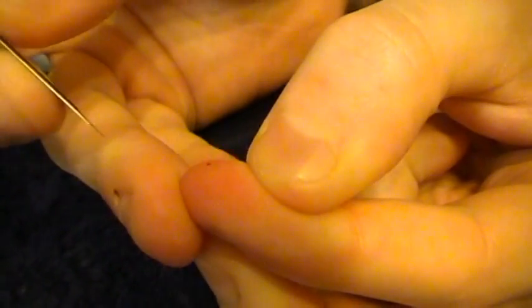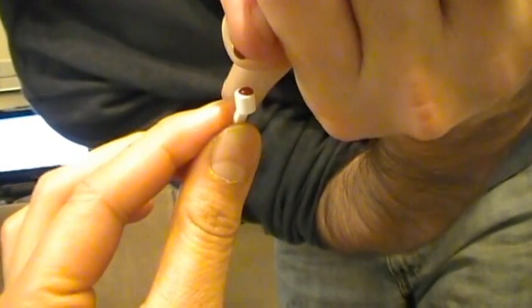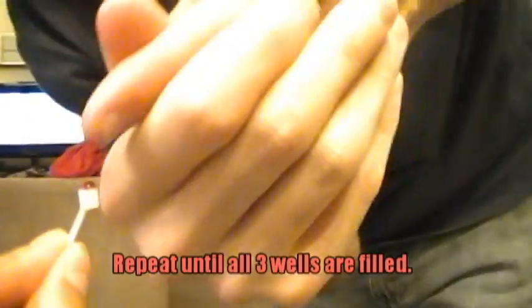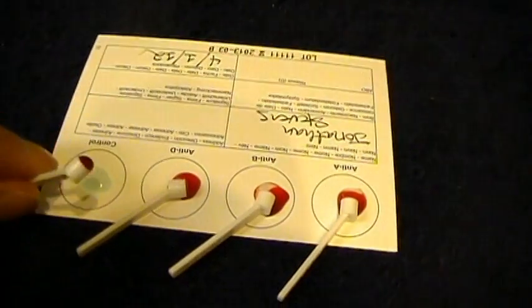Did you do it yet? Ow. Yeah, that kind of sucks. You're not squeezing. Good. Now I need to do that three more times. That's a big baby. It hurts. Actually, it didn't hurt that bad.